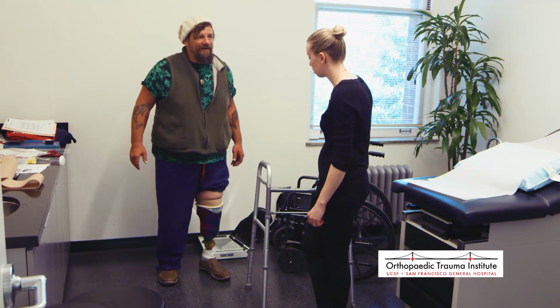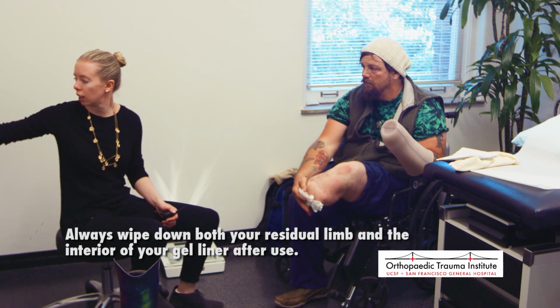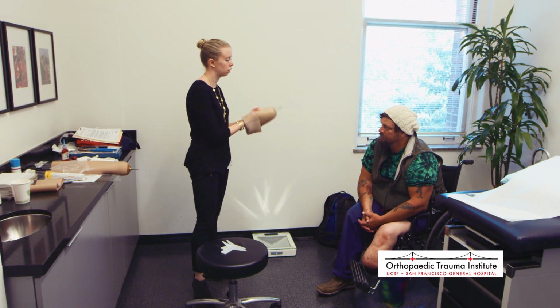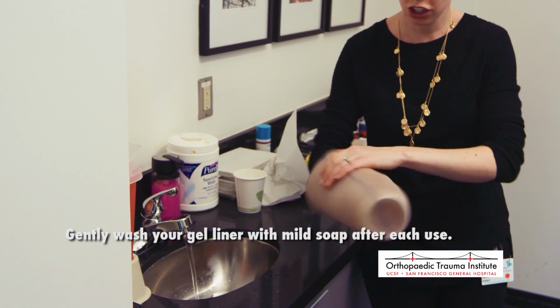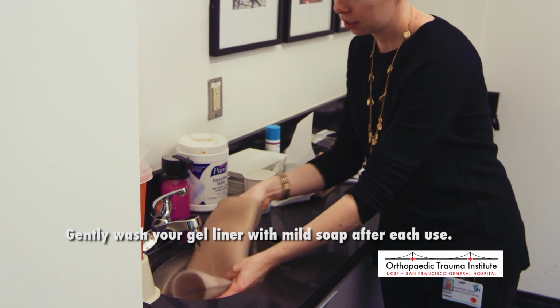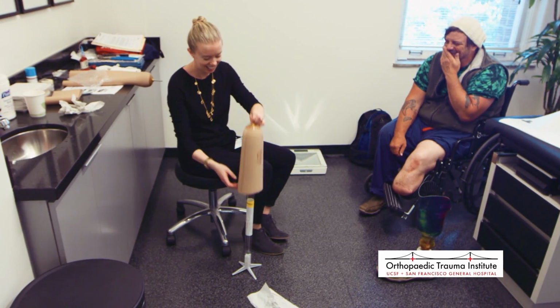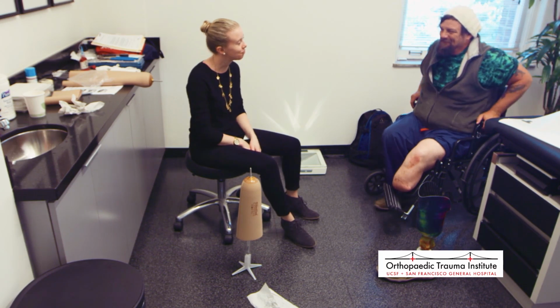During this process, Hannah takes some time to explain the needed maintenance. It's always important to wipe down both your residual limb and the interior of your gel liner after removing it, as sweat will build up on each. At the end of the day, turn your gel liner inside out and gently wash it in the sink, using only water and hand soap. It's important to never use dish soap or anything stronger than hand soap, as doing so can damage the liner. After washing, gently dry your liner and hang it on the rack it comes with or on its side. With proper maintenance, your gel liner should last about 6 months.